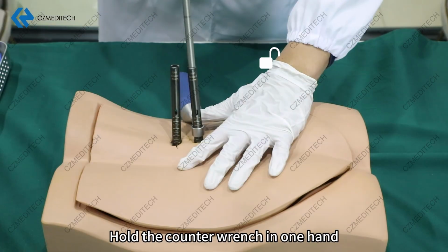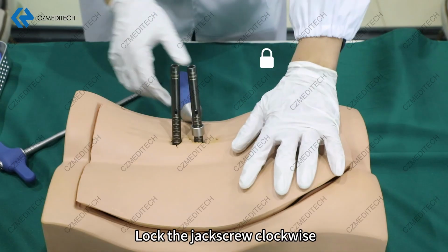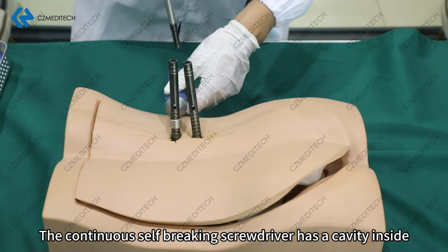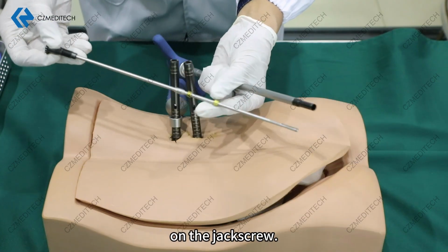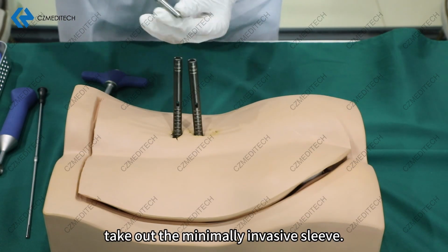Hold the counter wrench in one hand and the self-breaking screwdriver in the other. Lock the jack screw clockwise until the tail of the jack screw breaks. The continuous self-breaking screwdriver has a cavity inside, which can continuously carry out self-breaking locking operation on the jack screw. After locking all jack screws, take out the minimally invasive sleeve.